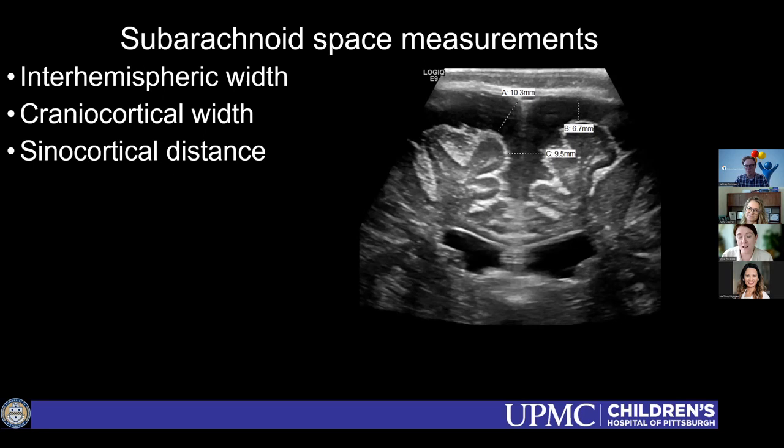But for us, as well as with the ventricular measurements, I think what's most important is to make a decision and do it that way, so you at least have some internal continuity. Or if somebody has chosen to do it a particular way, make sure that every follow-up ultrasound measurement is as close as possible to what was done originally.